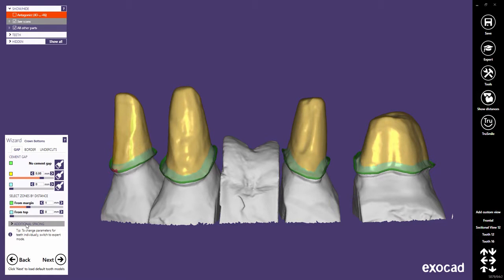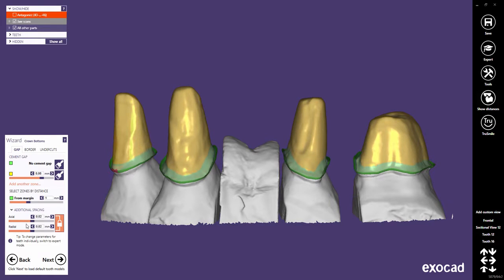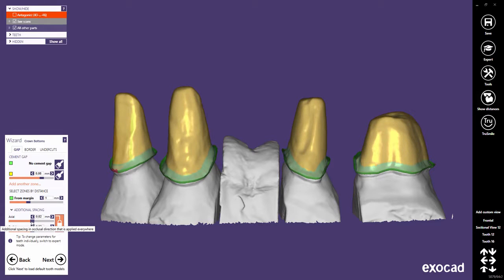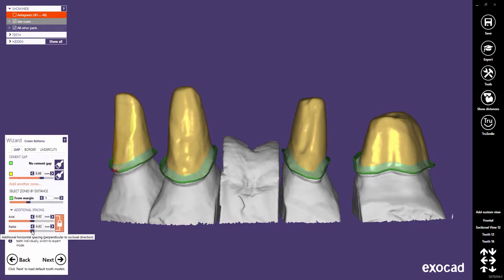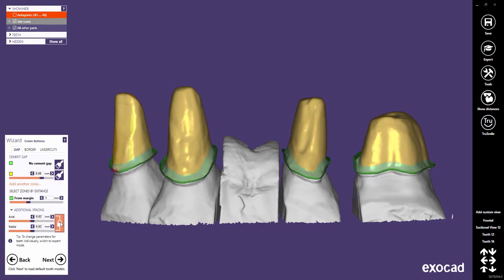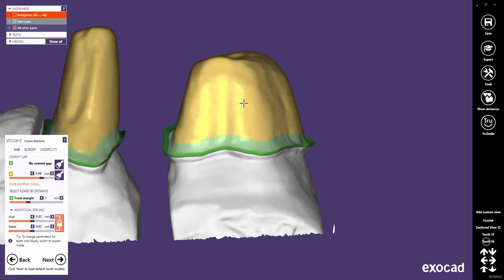The axial spacing will add offset in occlusal direction. The radial spacing will add offset perpendicular to the occlusal direction. Both sliders are locked so that offsets are added equally spaced to the three axes.